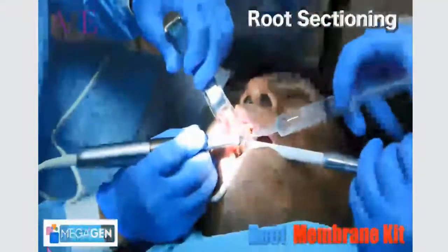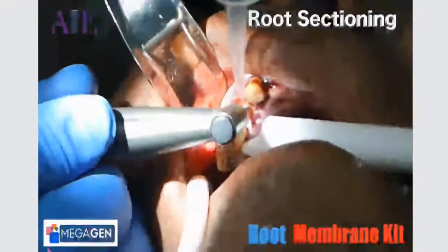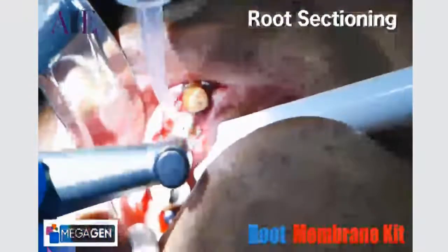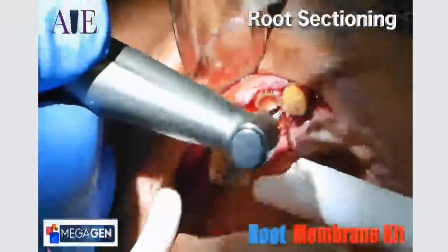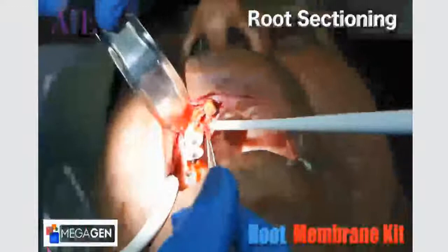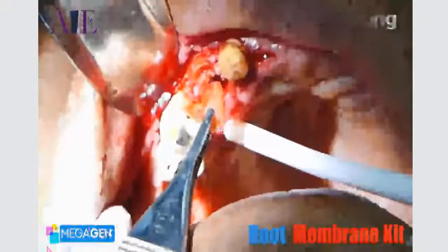So first we're going to look at sectioning the roots. We're going to utilize some of the instrumentation, which is well marked, so we can control the angulation and control the depth. And by the way, we can also do this in a guided approach as well, although we don't necessarily have all of the time in the world to discuss that today. So what we really want to do is carefully separate this palatal aspect of the root, and then you can see that the fragment needs to be trimmed and modified in order to receive the implant without touching that root fragment.